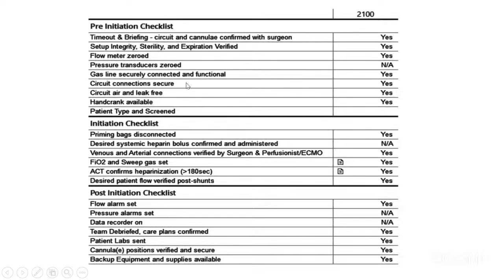So the most important thing when you prepare for an ECMO is, the few things which we need to understand, that the preparation should have a proper counseling team, a proper procedure team, and third is your support staff. And with a lot of ECMO training these days, if you have proper ECMO training, the amount of stress and procedural complications will come down over a period of time.